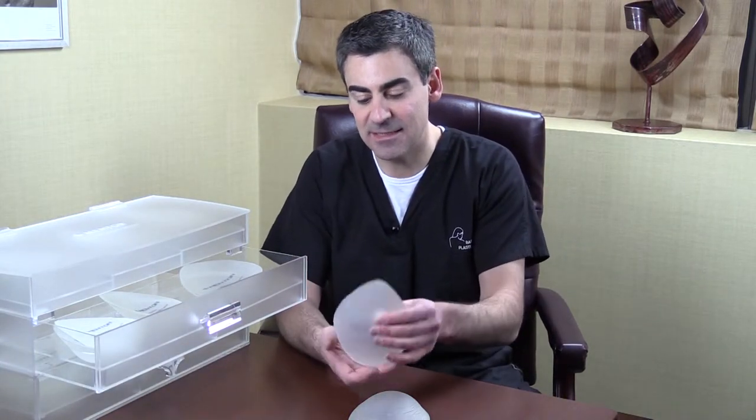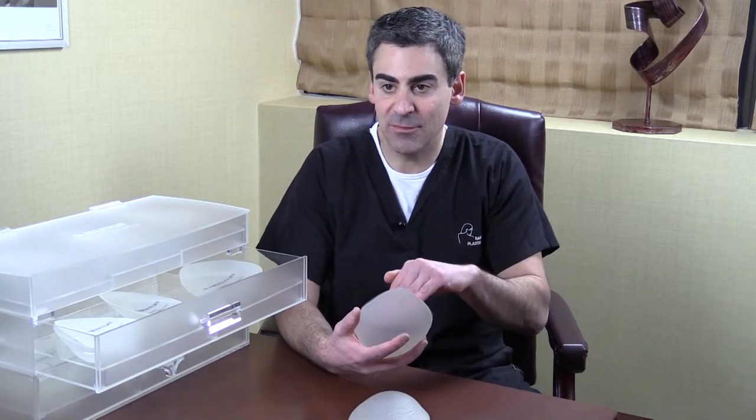So what we do typically during our second consultation is put you in a sports bra and then we place these sizers — this is not the actual implant, but it's used to help simulate what it would look like with it underneath the muscle. You try these on, perhaps put a shirt on over, and that really gives you a good indication of what you might look like after surgery.